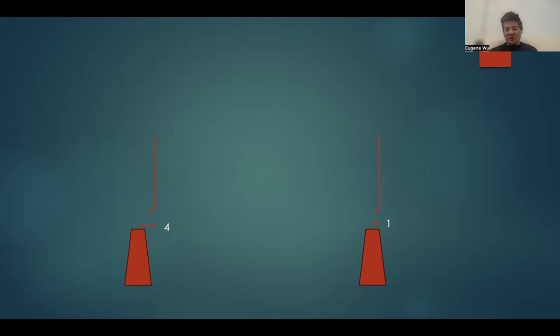Because what we want really, because in the RAO view, it's all overlapped. It's a foreshortened view. So if we turn it all the way to the target, we've turned way too far. What we need, in fact, is this kind of angle, because as we push forward in the RAO view, actually the wire moves very little. It should move very little.